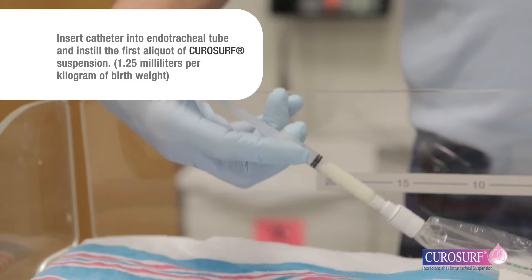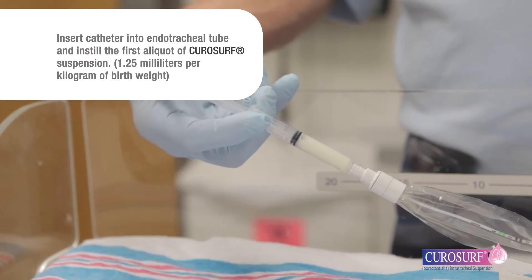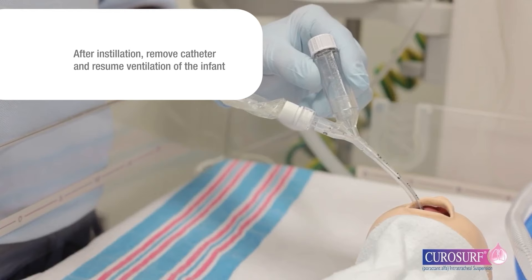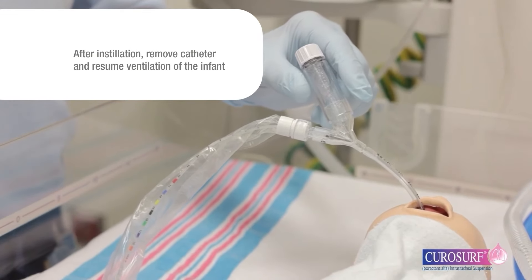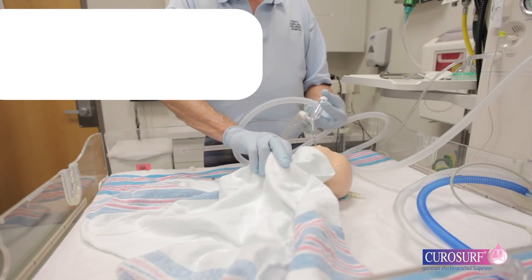Insert the catheter into the endotracheal tube and instill the first aliquot of CuroSurf suspension: 1.25 milliliters per kilogram of birth weight. After the first aliquot is instilled, remove the catheter from the endotracheal tube and resume ventilation of the infant with supplemental oxygen until clinically stable.